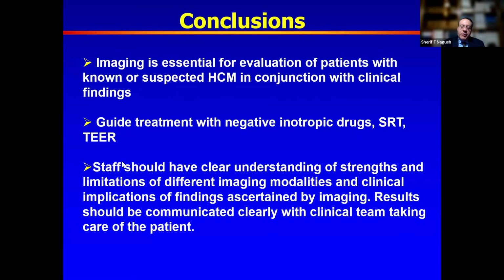That particular patient had no gradients at rest or Valsalva on a fixed dose, which was not a big dose, I believe around 2.5. Then that patient came postprandial, as opposed to earlier in the day, for her follow-up study. And now pretty high values were obtained. We brought the patient back in a fasting state, and again, we saw similar gradients.